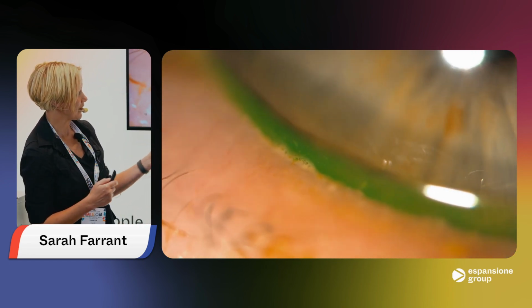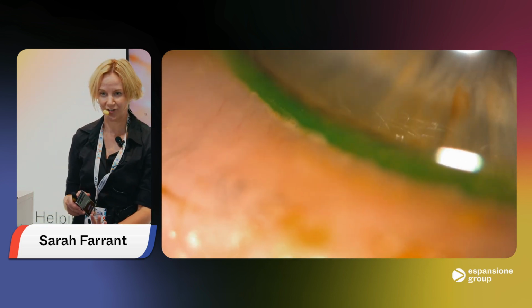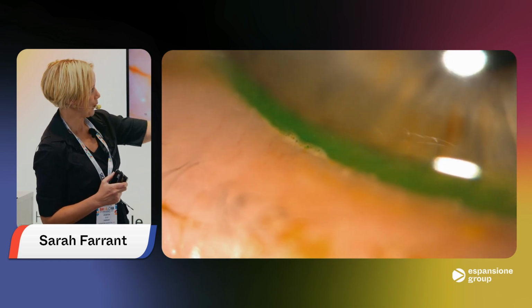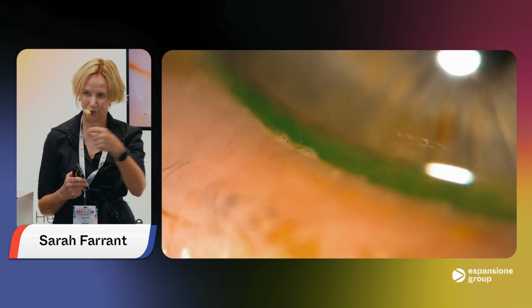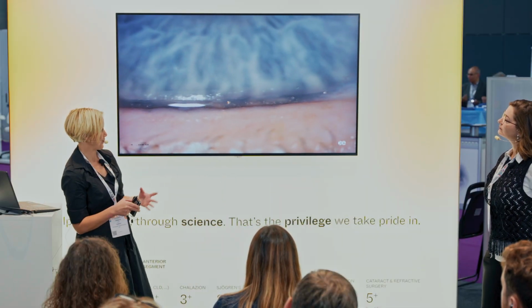So you can see from this video, this is a close-up of the lower lid, that what you're seeing here is not saponification. I wanted to give you some differentials. What this is, is just an accumulation of bits of meibum, and the problem with MGD is the meibum tends not to mix very well, so you get it sort of accumulating in clumps along the lid margin. Then this is also not saponification.